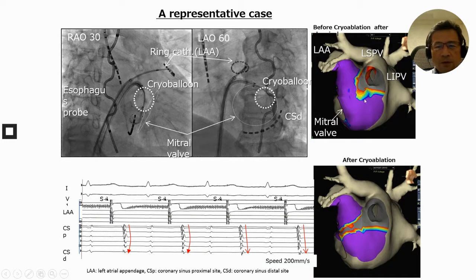In this patient, first we performed chemical ablation of the vein of Marshall, and we were able to create a damaged area, as shown here. However, we found a gap around this space. After that, we positioned the cryoballoon at this area, as shown here. We freeze, and then we were able to create a long conduction block along the mitral isthmus area. This finding was ascertained during left atrial appendage pacing. As shown here, the CS atrial sequence was changed, indicating a conduction block could be created at this portion.